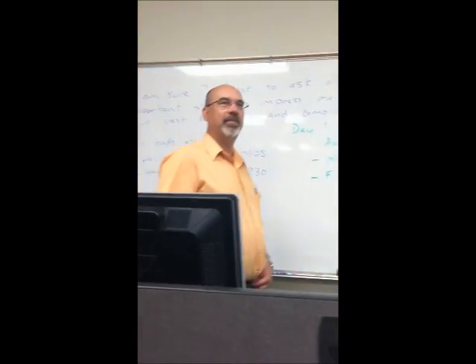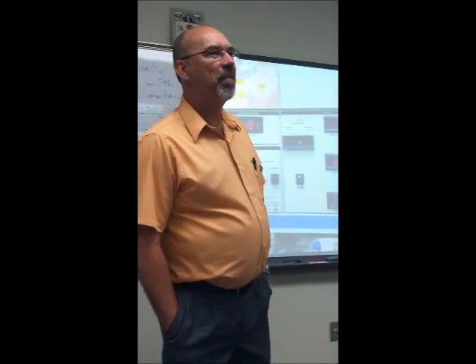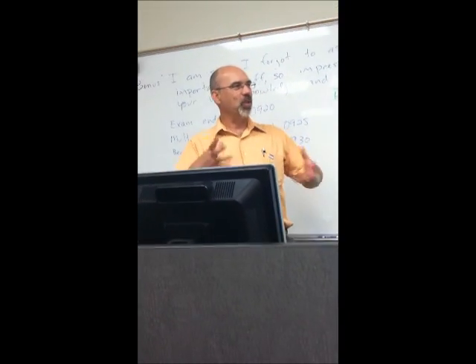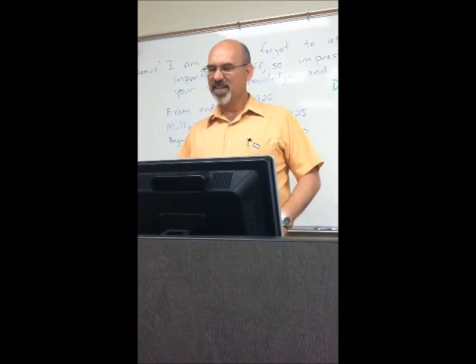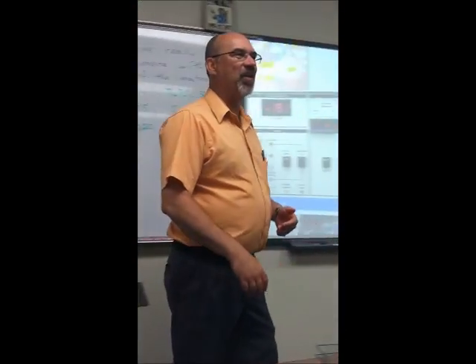So that really should take only a half an hour, right? Can we borrow against that? So if you have 4 ventilator checkoffs, you get 2 hours total that you can use. It sounds like The Price Is Right or something. If you're really close on this price, you can, is there, I don't know.